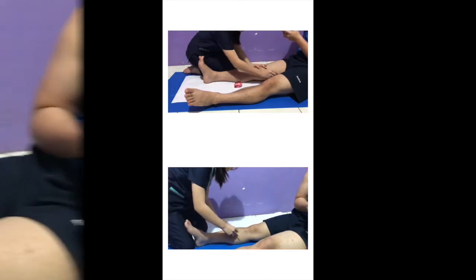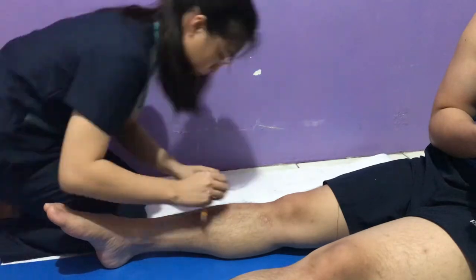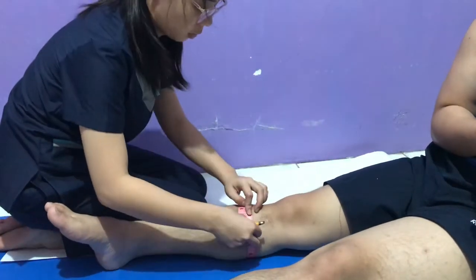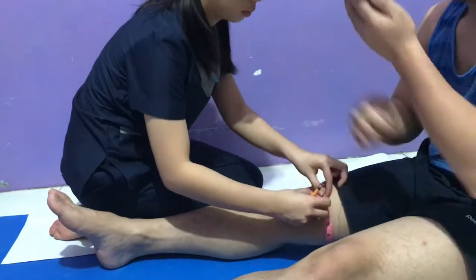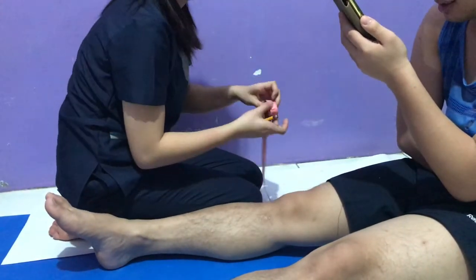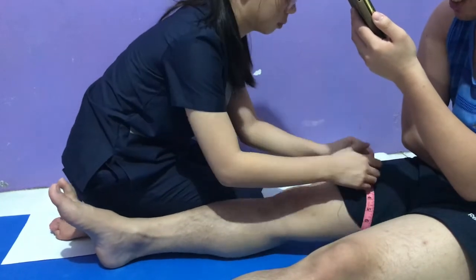On the lateral side, start marking at the hip joint. Measure the length of the medial side of your patient's thigh, leg, and remainder of the foot. Then measure the width and circumference of your patient's ankle joint, calf, knee joint, mid-thigh, and groin area.